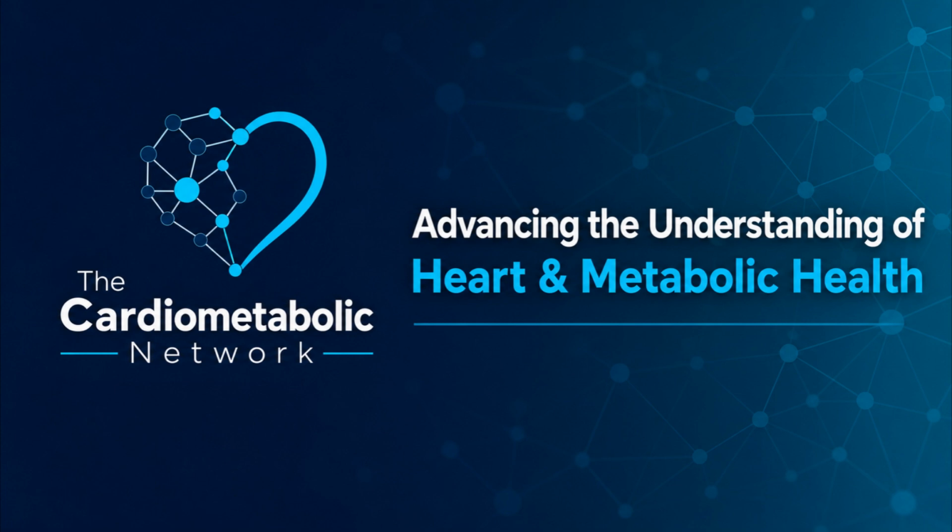The power of zero. Perhaps the single most clinically useful application of the CAC score is its negative predictive value. When the score returns zero in such a patient, it supports deferring statins, a meaningful, evidence-based de-escalation that avoids years of unnecessary medication, side effects, and cost.